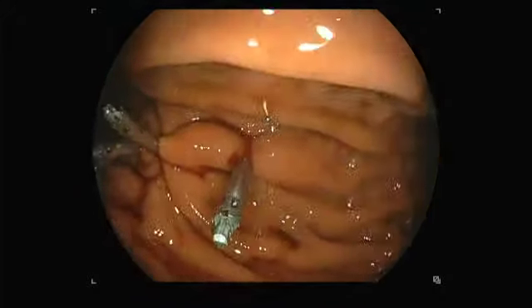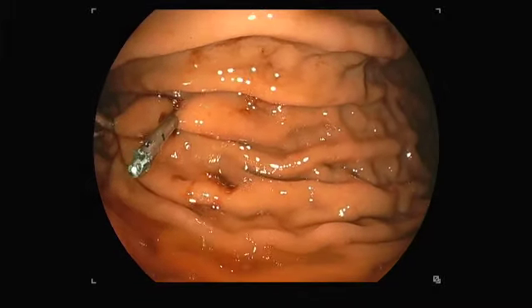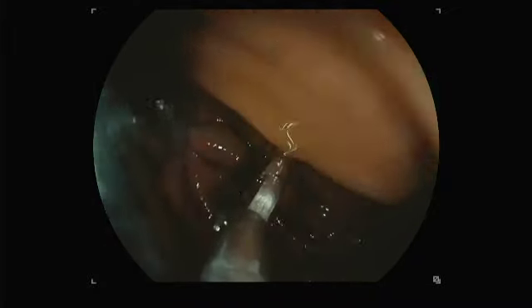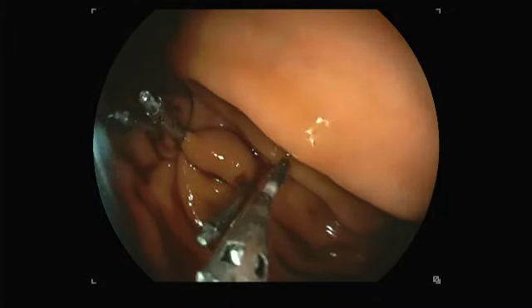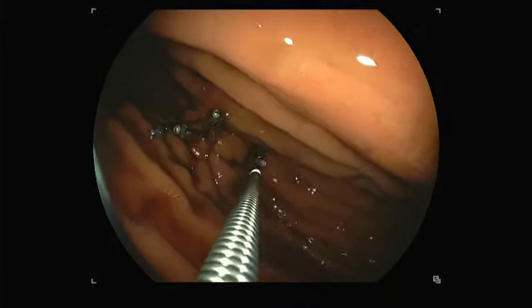The next step is what do you want to do if there is anything else? We felt that we should secure the hemostasis because the patient is going to go through chemotherapy to prepare the bone marrow for CAR T cell therapy.